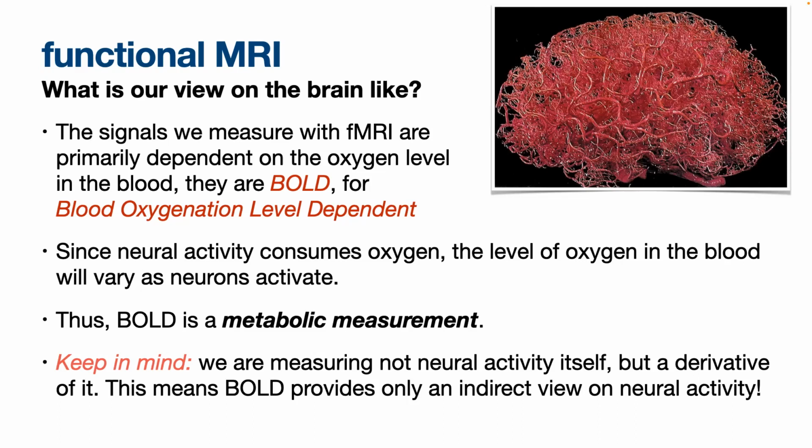Yeah, so on the 22nd of this month, Nikos Priovoulos, who is a colleague of mine at the Spinoza Center, an MR physicist, will tell you all about the different mechanisms that have to do with the nucleus of the atoms and how we manipulate the nuclei of atoms in order to produce these signals and images. He'll get into the nitty-gritty, but the major idea is that our brains are composed of a lot of water, and most of the imaging that we do has to do with this water. We use a huge magnet, which is a scanner. What we're manipulating is not neurons, it's really the magnetic alignment of the protons in the water in their brains. It's all very quantum mechanics in the background.